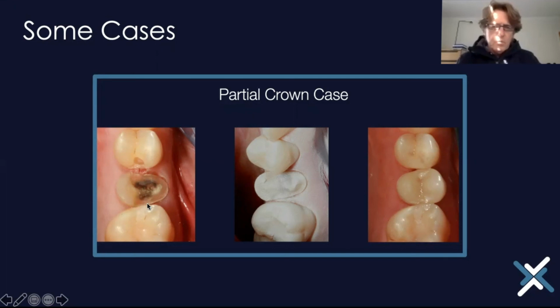You can do the soft tissue removal by using a laser like we did here, or maybe you can get away with just packing cord, maybe purple. That's normally a good size. Over here, you can see a very small restoration on the disto-occlusal aspect of the four. That is just a good little composite to be done. Please don't go and mill something out for someone there. That's really not nice to do. Go and fix that up with a small composite and continue with your overlay.